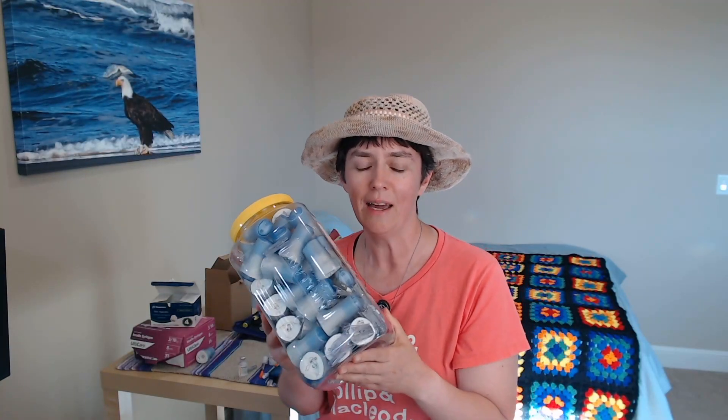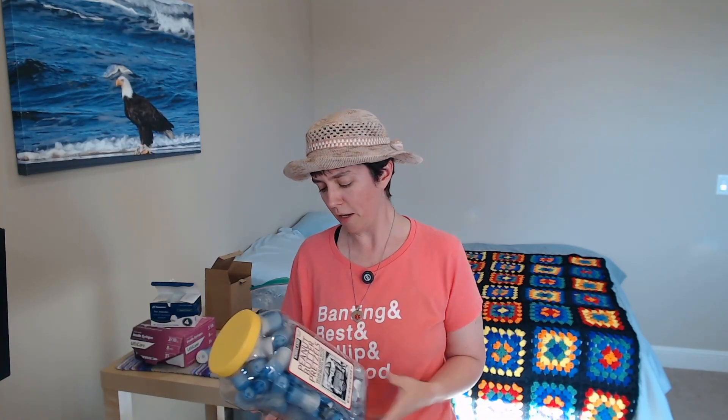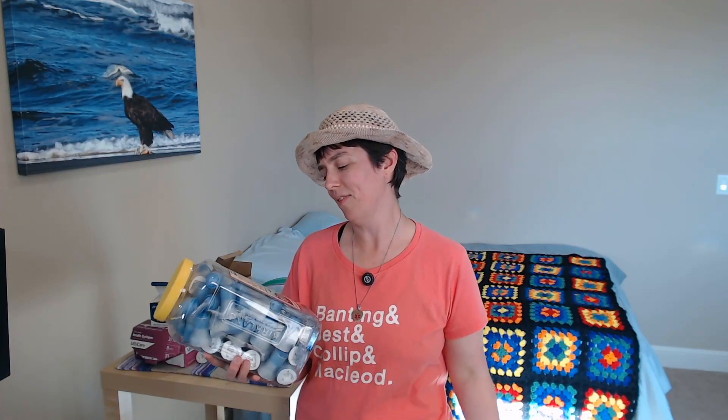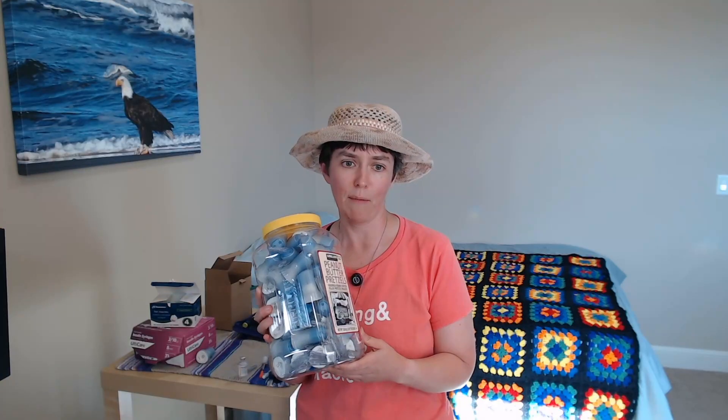Now I use an insulin pump, and all these things in this container are the injector pieces for the infusion set. The infusion set is a little plastic piece that goes right under my skin — that's where the insulin from the pump goes into my body. This is the tool for injecting that infusion set, and there's a needle inside these plastic pieces. You can't just throw it out, so I got this peanut butter pretzels container, and I've been saving them up. My pharmacy will take this and will discard of it properly.